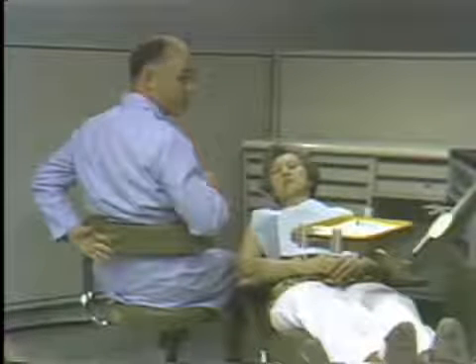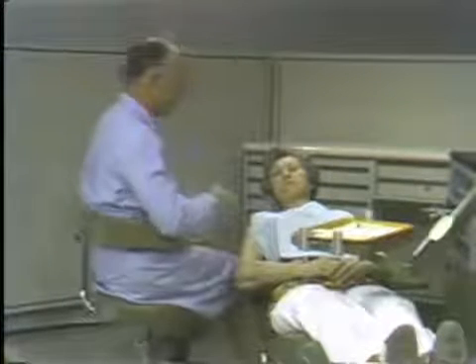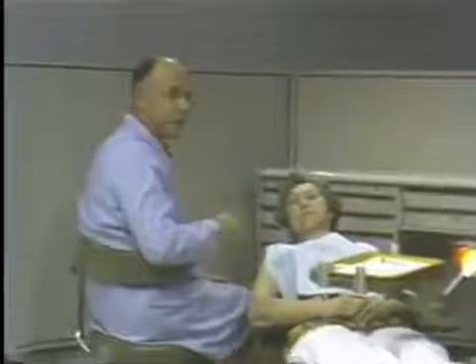This is the view you should have into the lower right quadrant. The patient should turn her head toward the operator so that you can see more easily into this quadrant. Note the position of the operator. My back is firmly against the backrest for support. And the back is straight. Now in this position, this is excellent, of course, for all operating in the lower right quadrant.